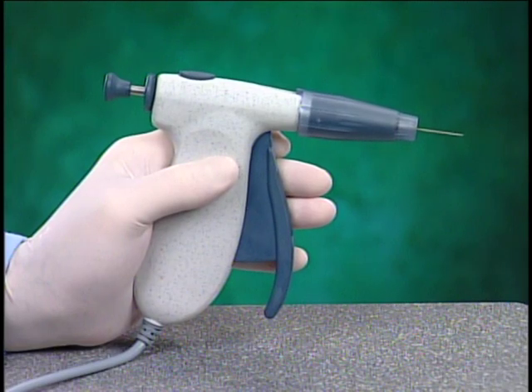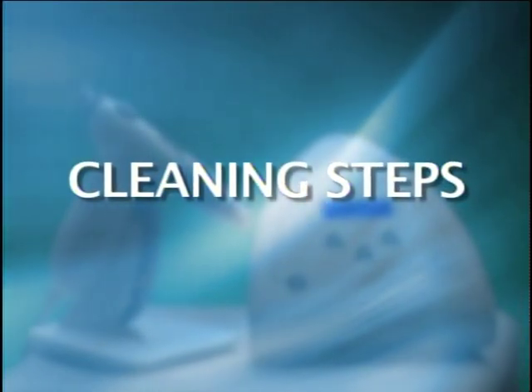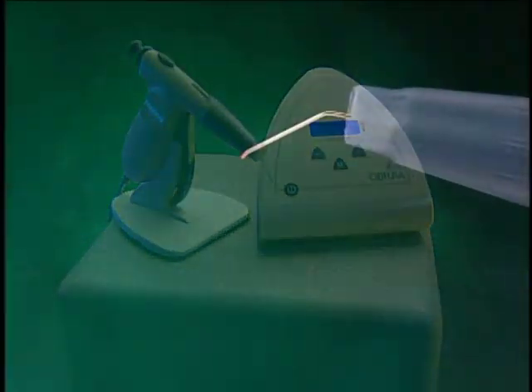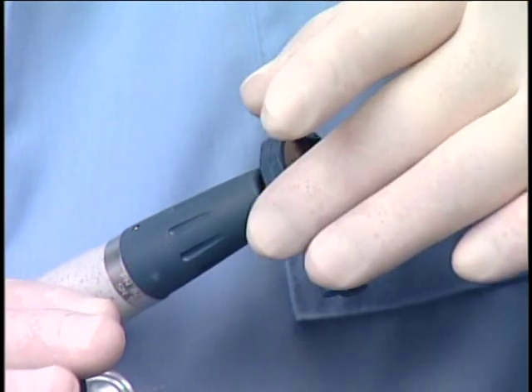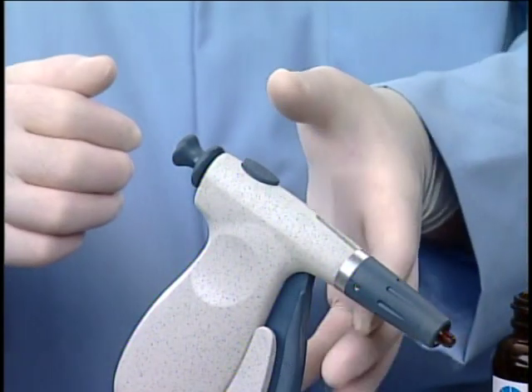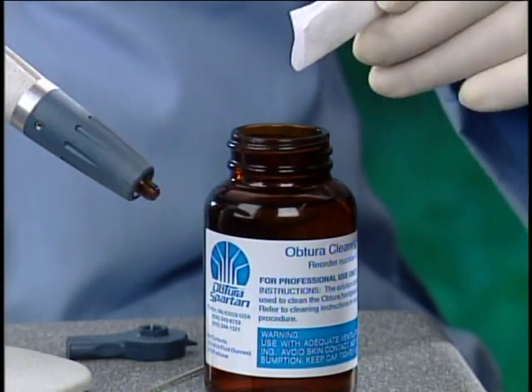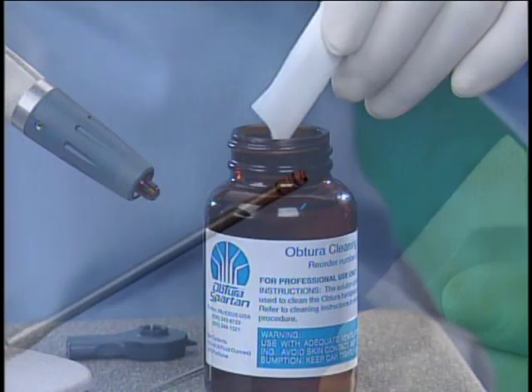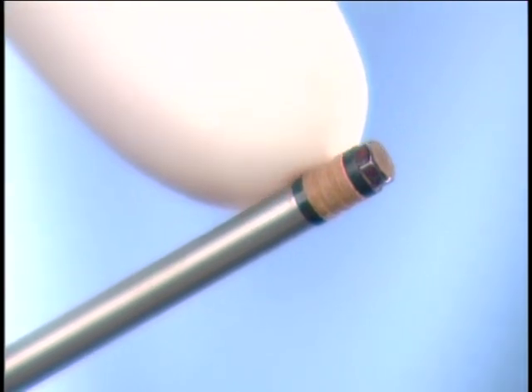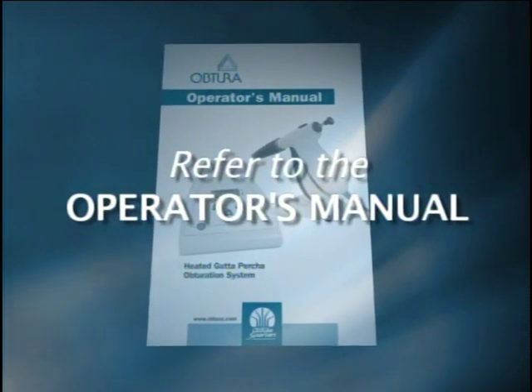The Obtura handpiece should be cleaned daily to prevent buildup of excess gutta percha within the heating chamber. While the unit is still at operating temperature, express all gutta percha and, using the multi-tool, remove the needle nut. Place the handpiece in the handpiece base, depress the plunger release, and remove the plunger shaft. Now turn the unit off. Using the Obtura cleaning solution and a gauze sponge or tissue, remove any gutta percha from the plunger seal and shaft. Inspect the plunger seal for tearing or cracking and if damaged, replace it. Please refer to the operator's manual for this operation.